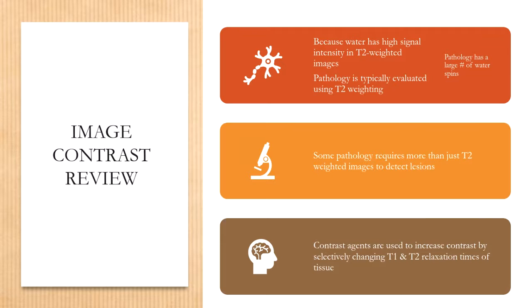So the first thing we're going to review is image contrast and how that relates to introducing contrast, injectable contrast or oral contrast, to the patient.